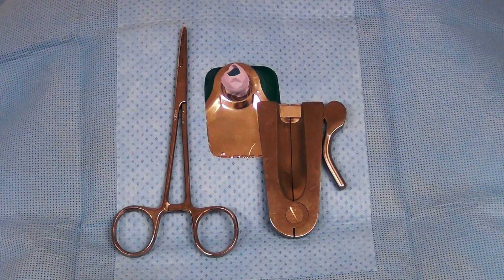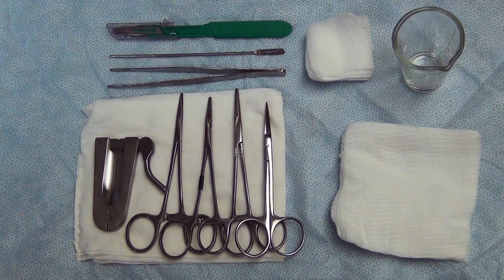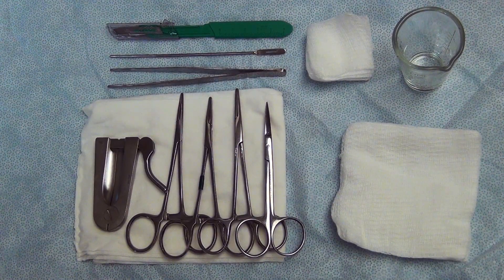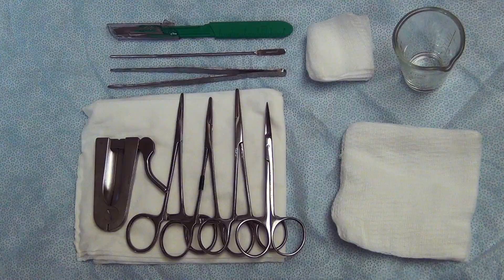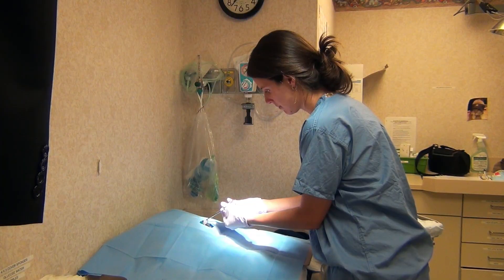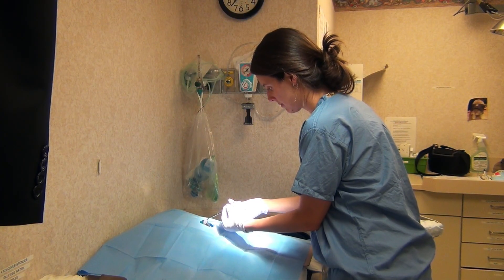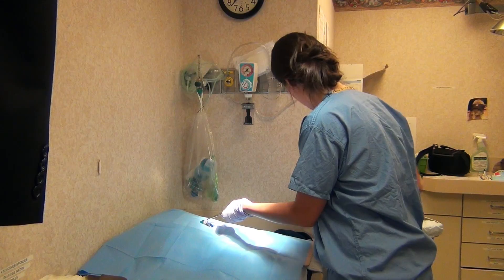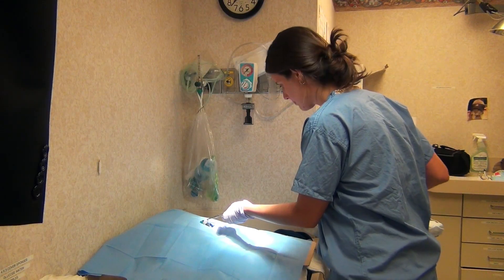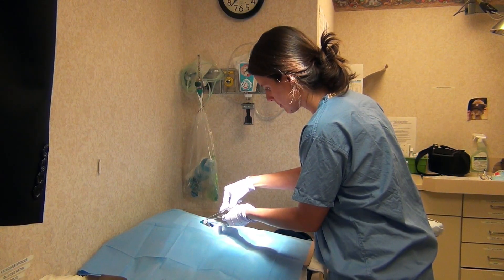Students and residents are typically exposed to this procedure on the postpartum floor in a hands-on learning approach. In this video we will demonstrate a simple and inexpensive model that can be used to teach basic circumcision techniques through simulation.